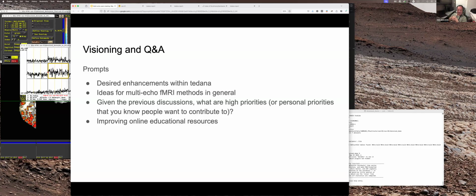So yes, Rick. IRL. There's still two things I would like to consider for tedana. For example, in that one regressor in the visual cortex that had that large drift component, in the context of external regressors, it might be nice to get some of the decision making orthogonalized to things like drift and possibly even censoring.